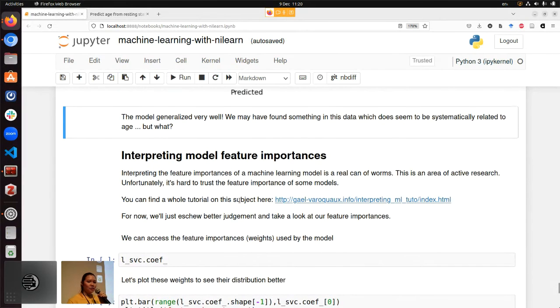How to interpret a model that you train is a very big topic in the field, and there is a lot of active research on this kind of thing. The simple answer to this very complicated question is we don't really know what is going on. It's very complicated. There is a paper, a tutorial blog post, I'll direct you to read as extra material over here.